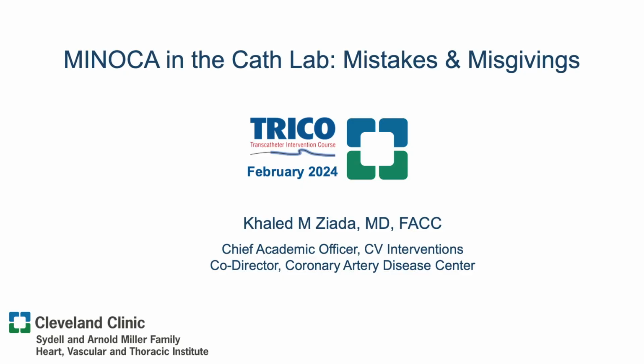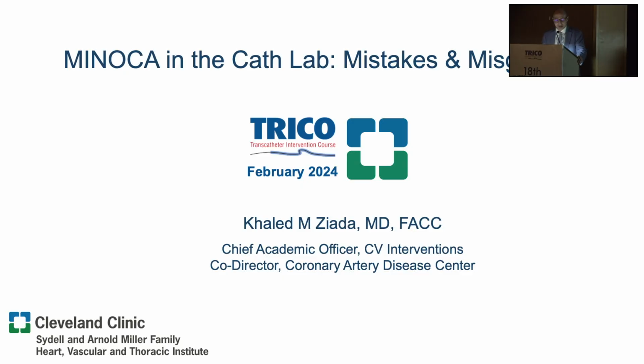Over the last couple of days, we saw an extensive amount of coronary artery disease, and so today, for a change, I'll show you some angiograms that don't have any coronary disease, because you need a break. So the topic is MINOCA in the Cath lab, mistakes and misgivings. And we'll just cover MINOCA in general.